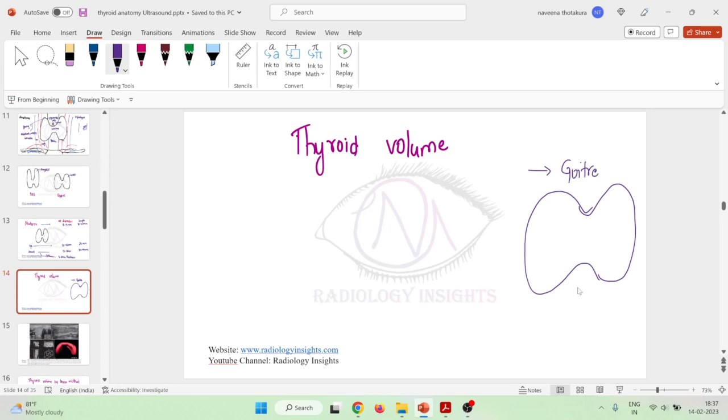So this determination of goiter size is very important to know the calculation of iodine 131 dosage, because we have to give the patient iodine 131. In such cases, in order to calculate the dose of iodine 131 in cases of thyrotoxicosis with goiter, we need to know the size of the thyroid gland, which can be calculated with the help of the following formula. Thyroid volume can be calculated by using the linear parameters itself and also with mathematical formulas.